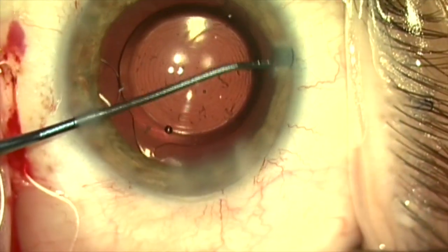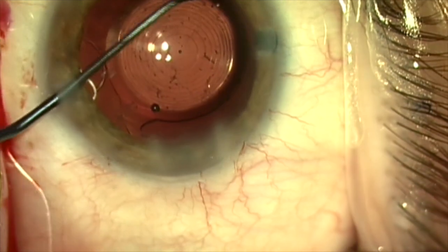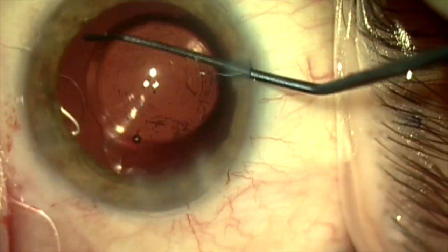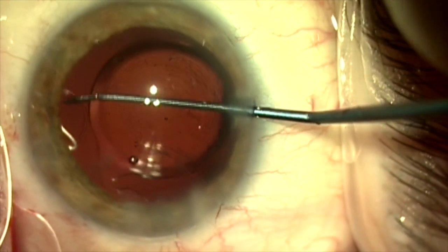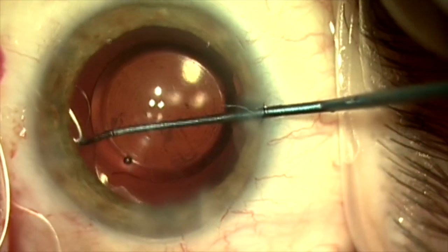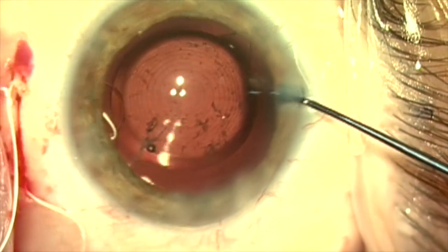We're going to sweep the anterior capsule for lens epithelial cells. I feel that this is very important to prevent capsular phimosis, which can cause displacement of the capsular bag complex. Here we are going ahead and sweeping these lens epithelial cells.